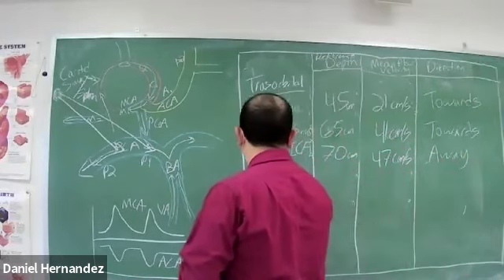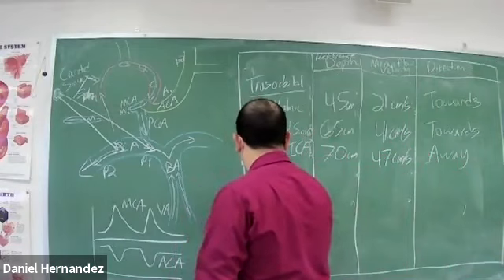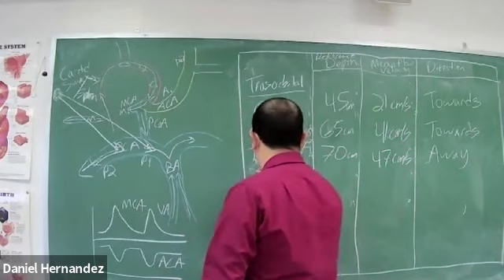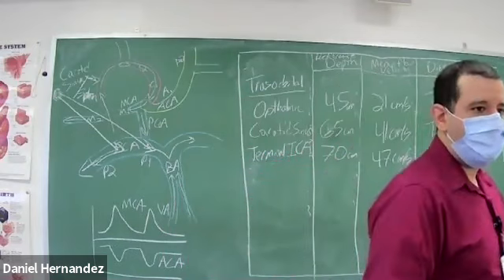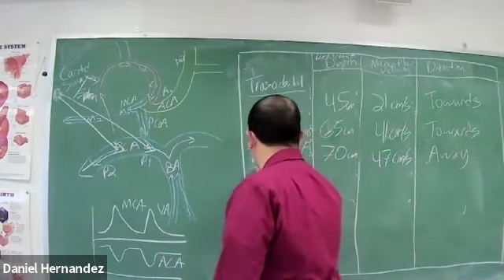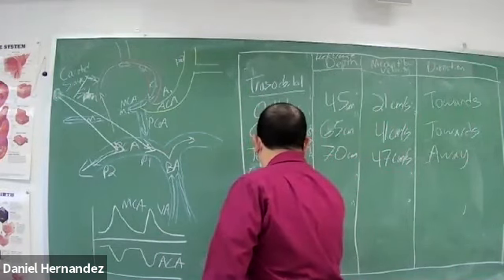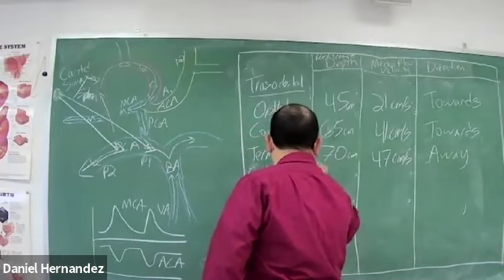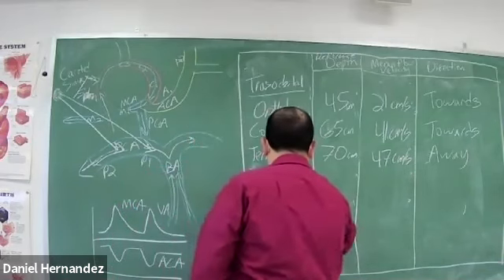And the suboccipital, so that's that posterior window. We'll have our vertebral artery.